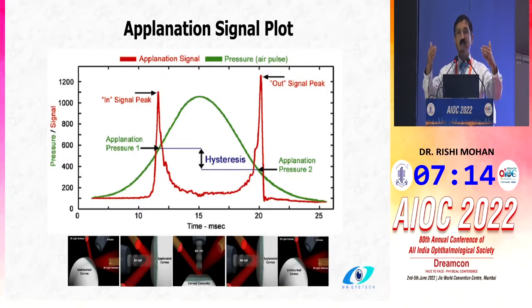And then, of course, the cornea comes back to its normal convex shape, but in this process, the cornea also shows some rebound or flutter, and because it's a viscoelastic tissue, that entire thing is monitored by these machines, and lots of data is derived from it.